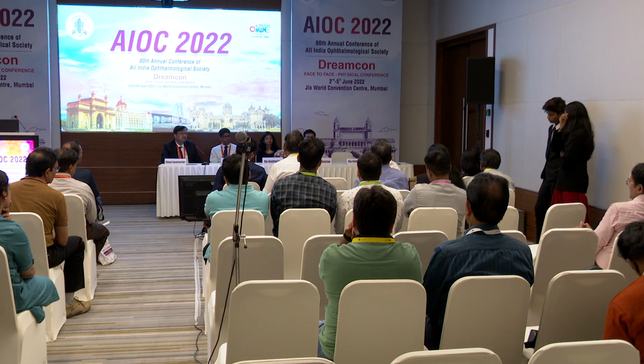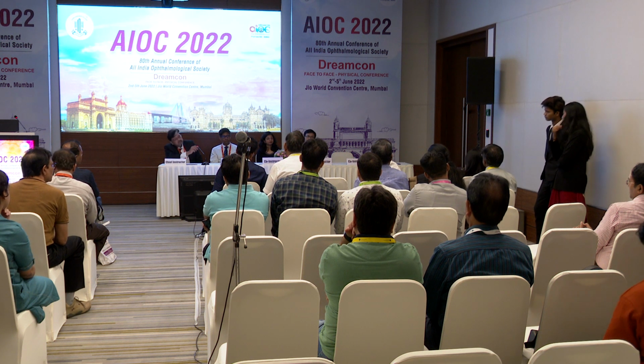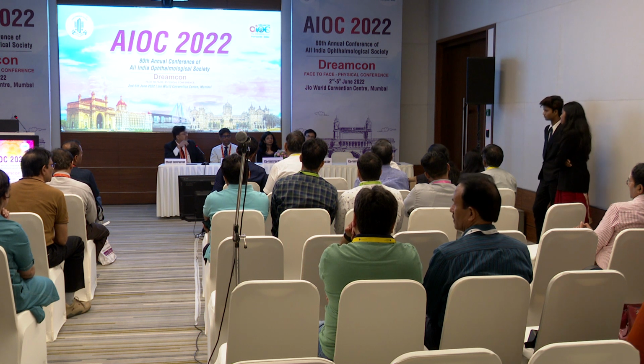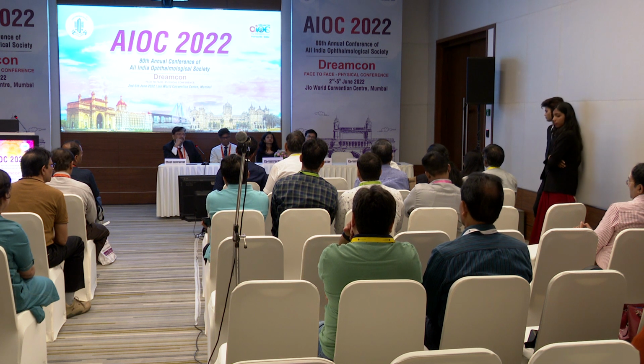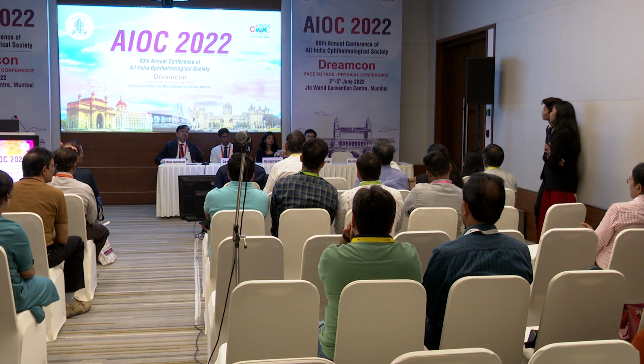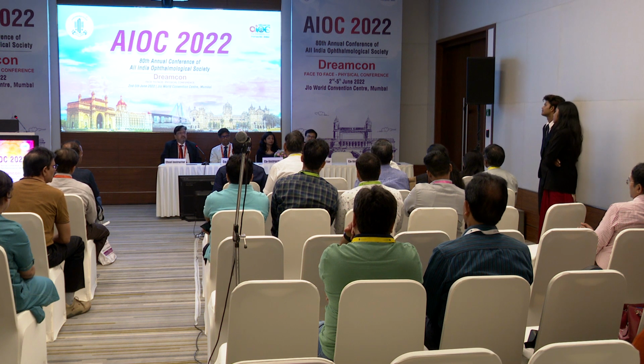And TASS was first reported with Alcon BSS in the US. So that's a paradox, but we have come a long way from that. Use good quality BSS, and if you have any incident, you should report it on the WhatsApp forums or report it to AIOS so that everybody knows that this particular company, this particular batch has a problem, and you can pull it out of your practice. That is the only thing that can save you.